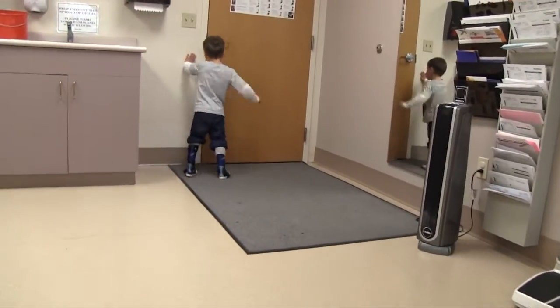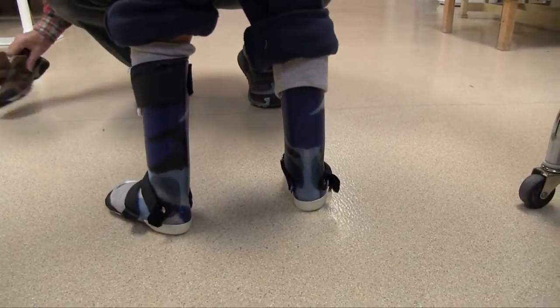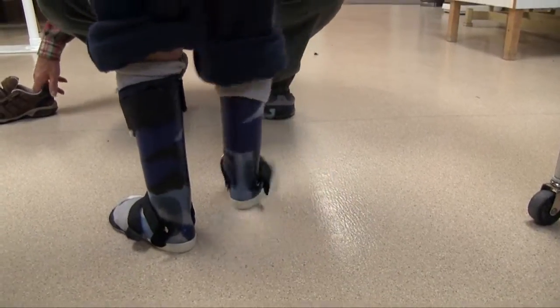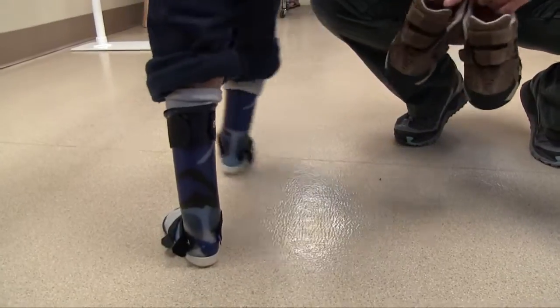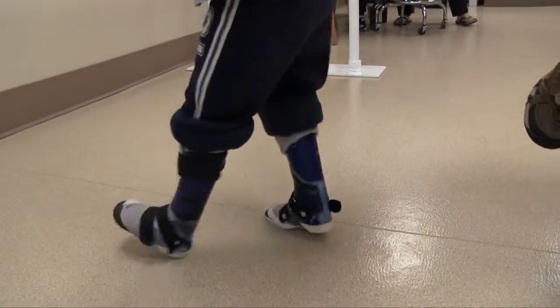So we will actually remake the braces with a dorsiflexion angle of minus 2 degrees. By the time we've implemented the brace and the shoe together, that final tibial angle should be at 3 degrees.